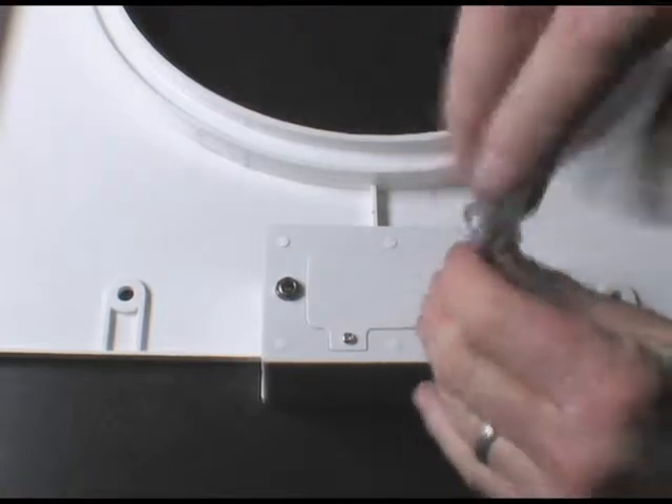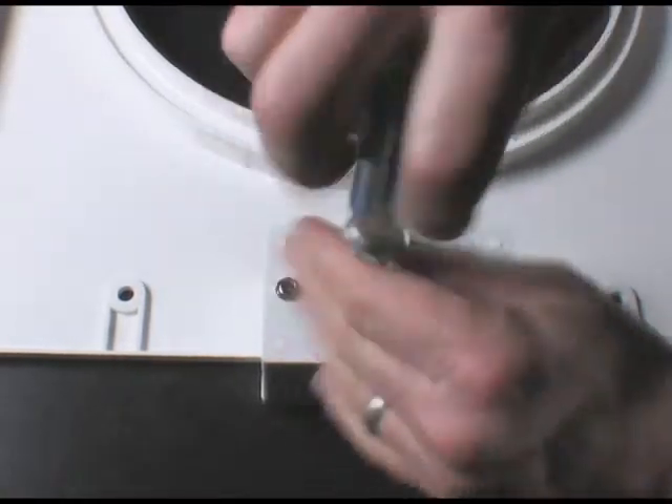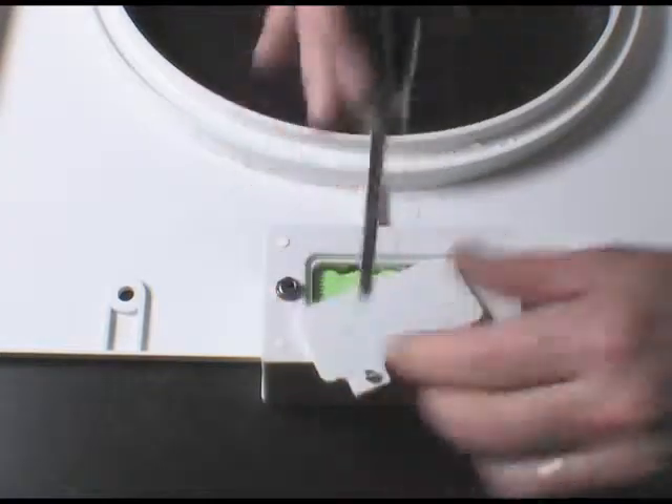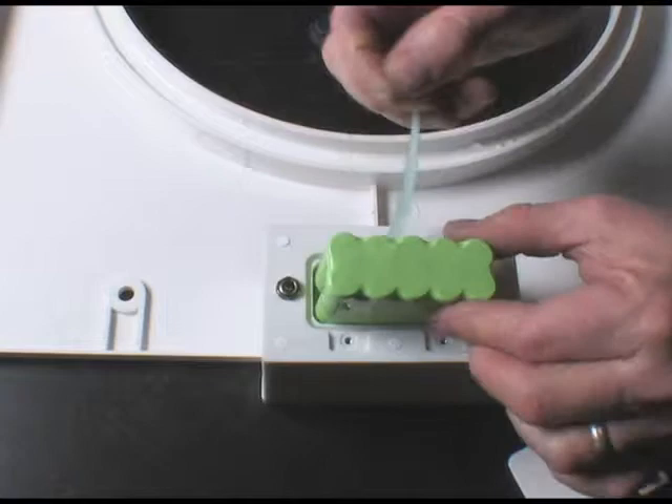Battery removal and replacement instructions: Remove the two Phillips head screws from the battery compartment, then remove the battery cover and pull the silk battery lift ribbon. Unplug the battery connector.